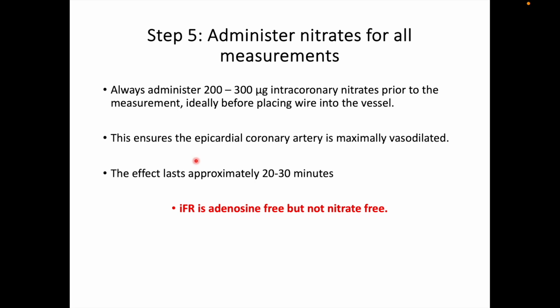And now IFR is adenosine free but not nitrate free. So remember, nitrate has to be given for both FFR and IFR.